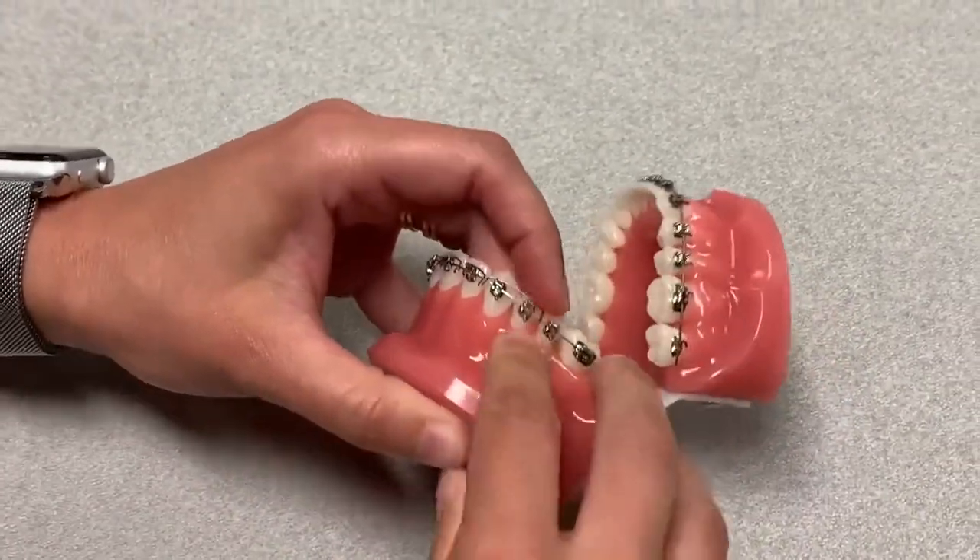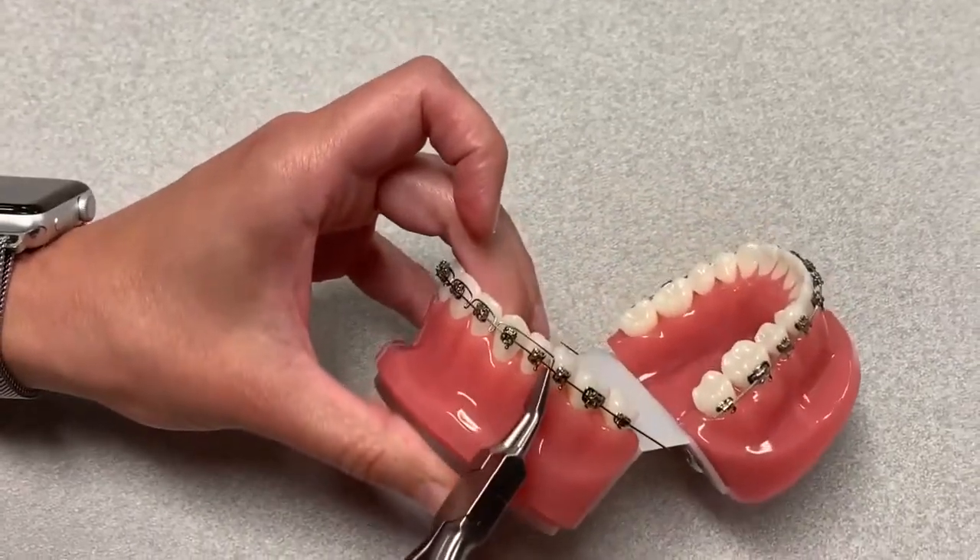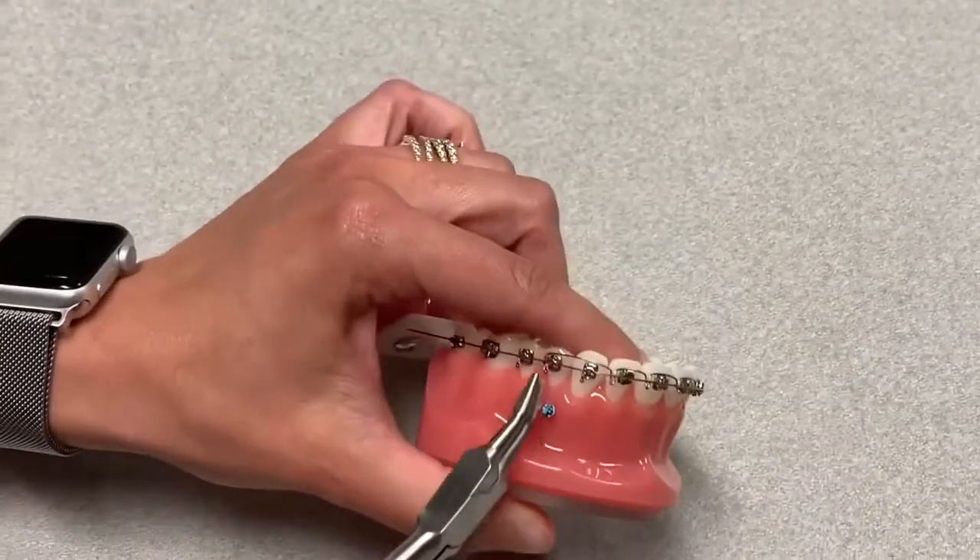So now you would go through and you would crimp here, and crimp the other side.